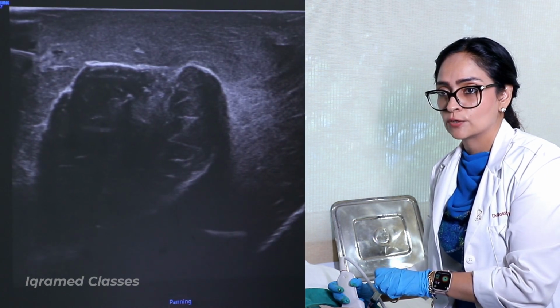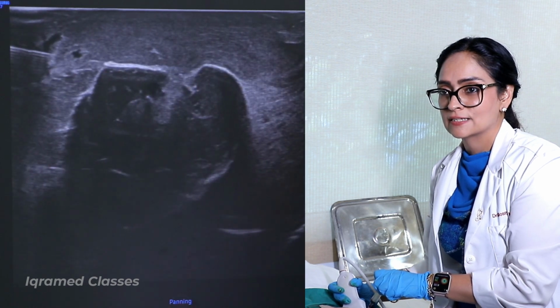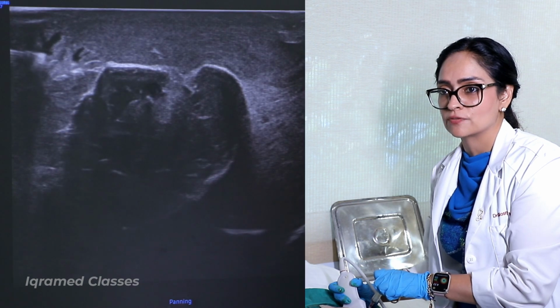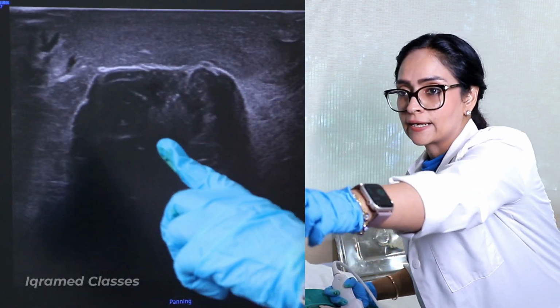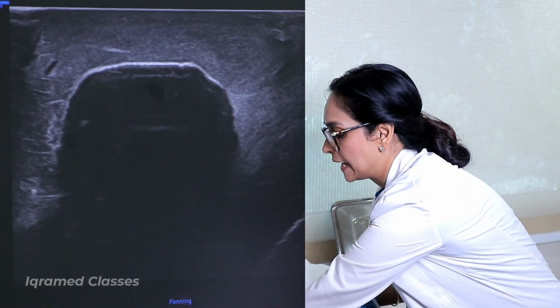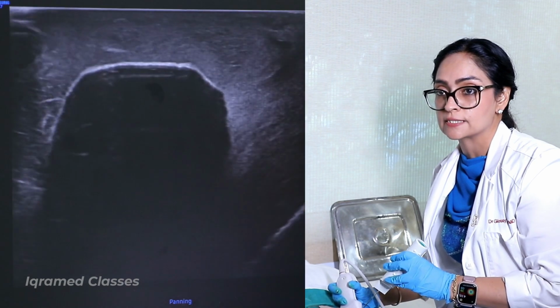See, look at this, how the breast tissue is showing the lignocaine being inserted. You can see it very well, and we take out the needle. Now let the lignocaine act, because that will be our site where we give a nick, and after giving the cut, we are going to insert.